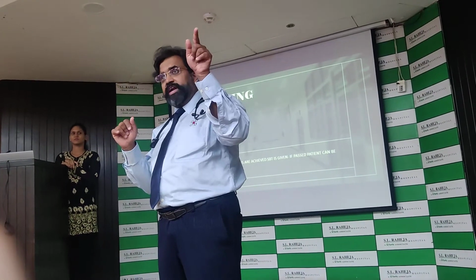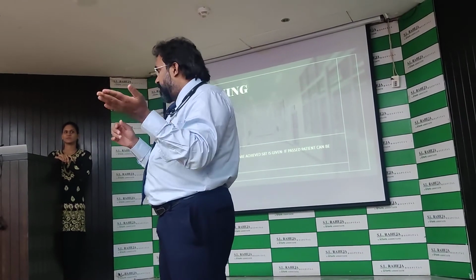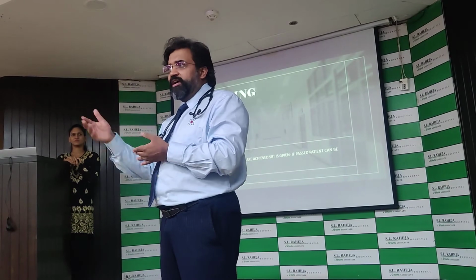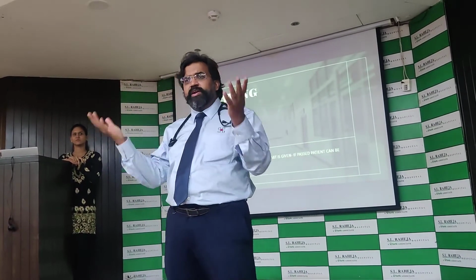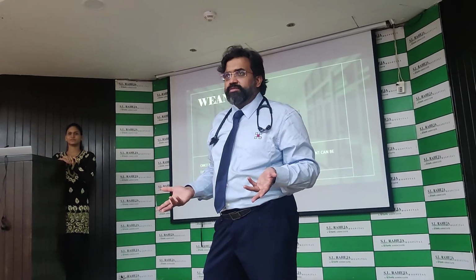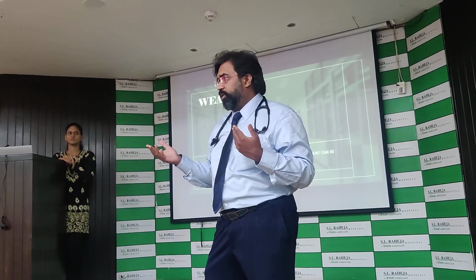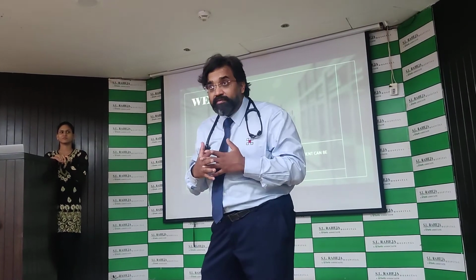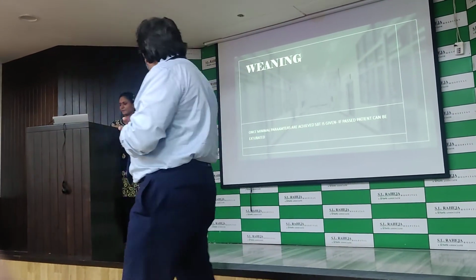Now you look at the pressure on that level. If the pressure support has come to the minimum set, that is what your CPAP is. If he is fully spontaneous, he has undergone an SBT. The ventilator automatically goes to an SBT and will tell you that 1 hour has been done already. So in effect, weaning time will come down. Otherwise, we don't know. Unless you stand at the ventilator and spend time, you will not know. Okay, you understood the entire thing?